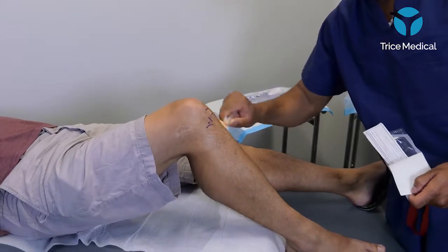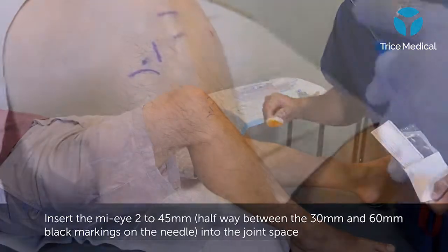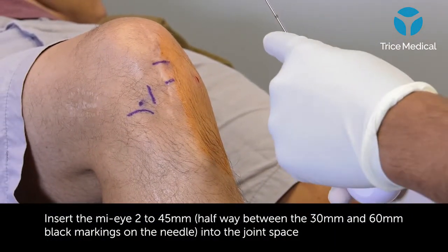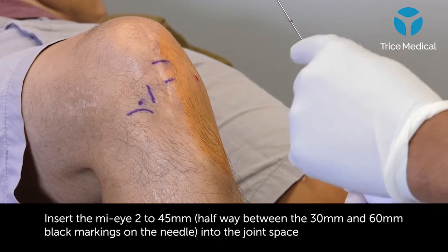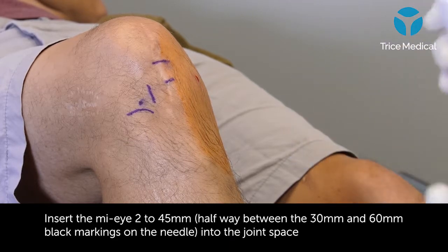I prep out this portion here. There are two markings on the needle tip — at 30 and 60. The sweet spot to always know you're inside the joint at the medial or lateral compartment is 45, splitting the two.